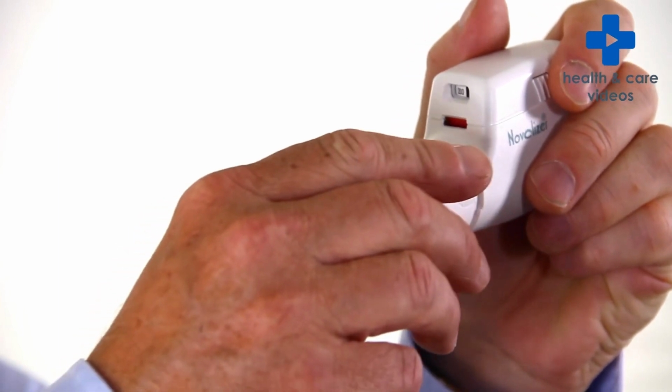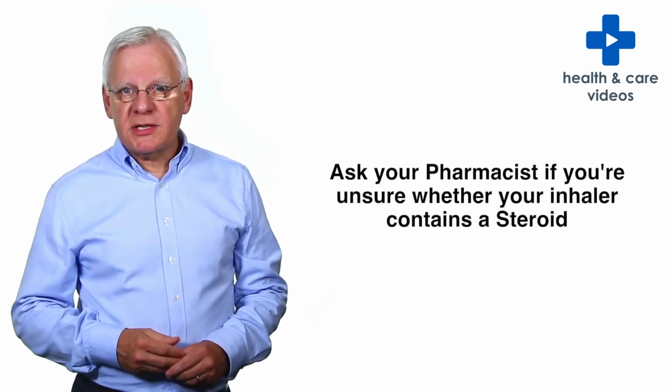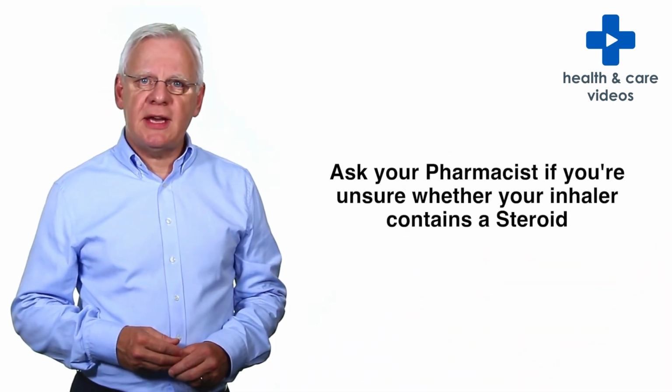When you're finished, replace the protective cap over the mouthpiece. If your inhaler contains a steroid, brush your teeth or rinse your mouth with water and spit it out after every use to prevent mouth infections. Ask your pharmacist if you're unsure whether your inhaler contains a steroid.